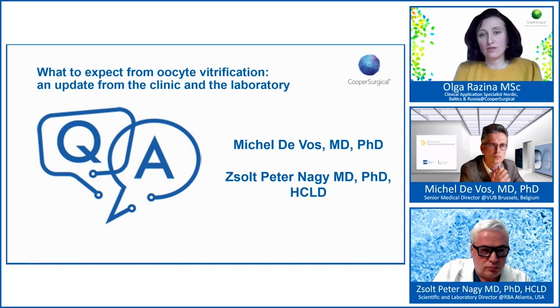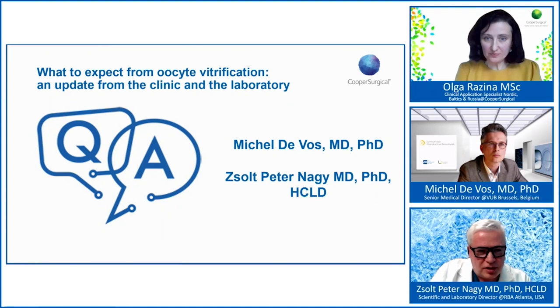You mean during the warming procedure, yeah? So as we could see from your presentation as well, you perform this stage under oil. No, that was not under oil. That's without oil. But, okay, it is possible to use an oil cover too. Okay, yeah, great. Thank you.